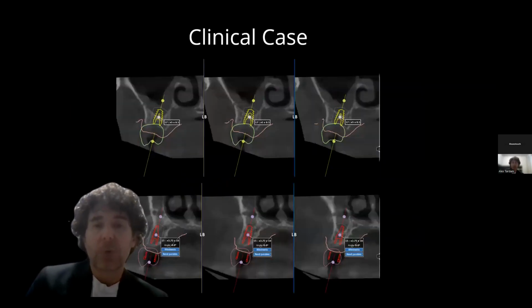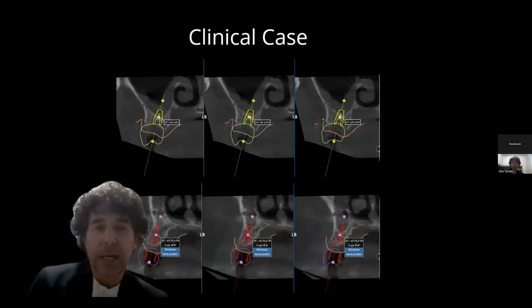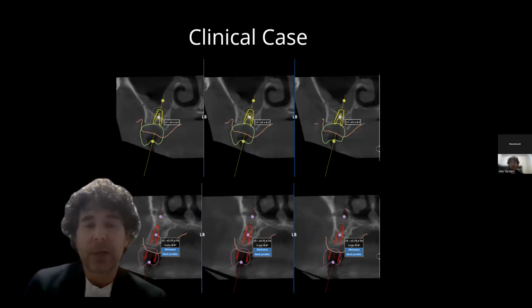As for the more distal site, however, we find a completely opposite situation. We have the buccolingual distance is very wide, and the maxillary sinus has also become very large, so we already know that for our crestal sinus lift, we either place a large amount of biomaterial, which is something I'm not particularly fond of, or we probably won't be able to achieve a complete lift. The entire maxillary sinus.